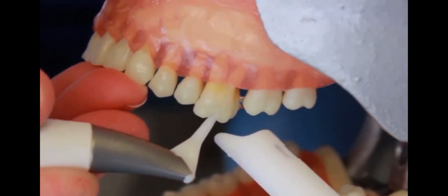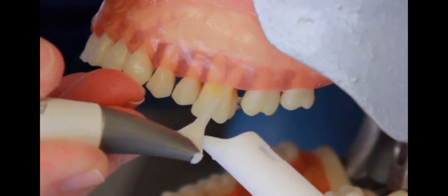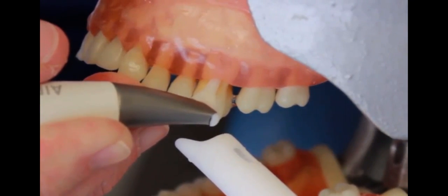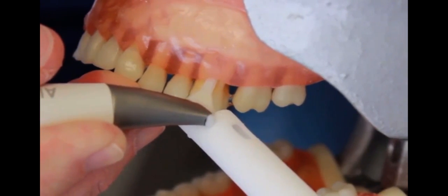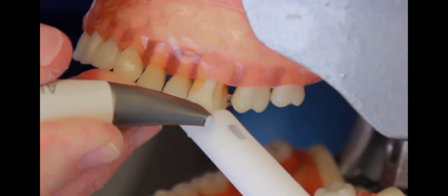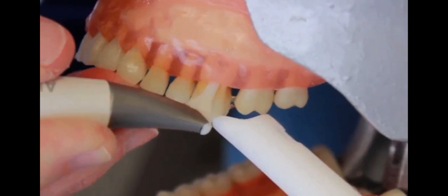We have a 10 millimeter plastic flexible tip that can be placed subgingivally. The idea is to gently place it in the pocket until you feel that junctional epithelium at the base of the pocket. You want to make sure you have your HVE available — it's really important in removing those aerosols. It is an indication for use when you're doing subgingival air polishing. I'm going to turn this on.